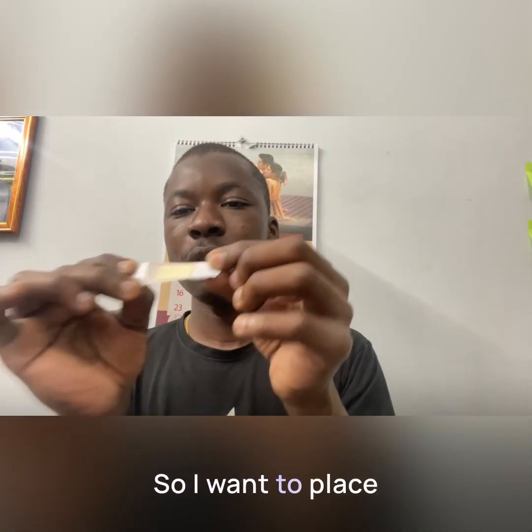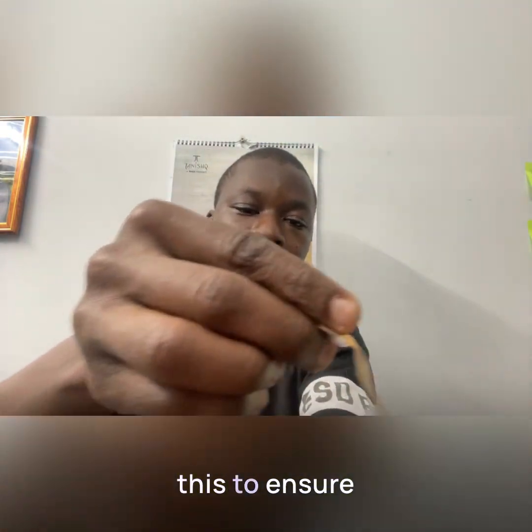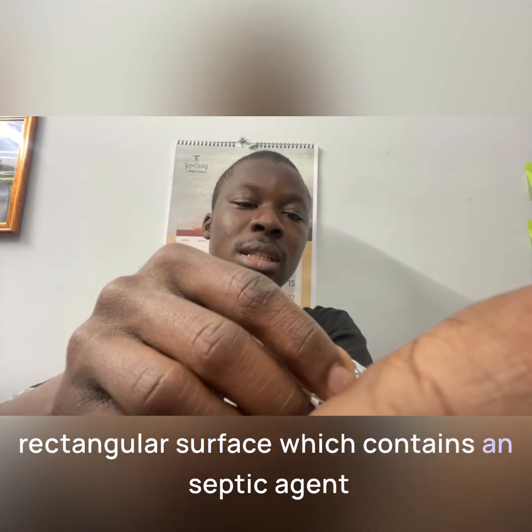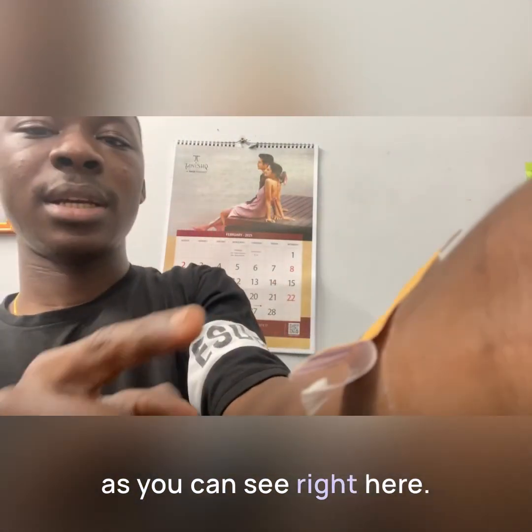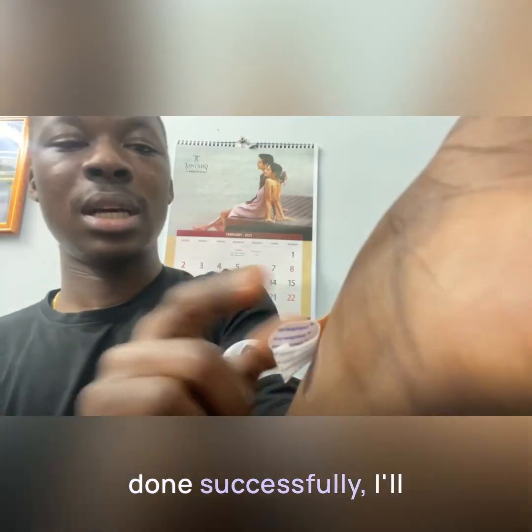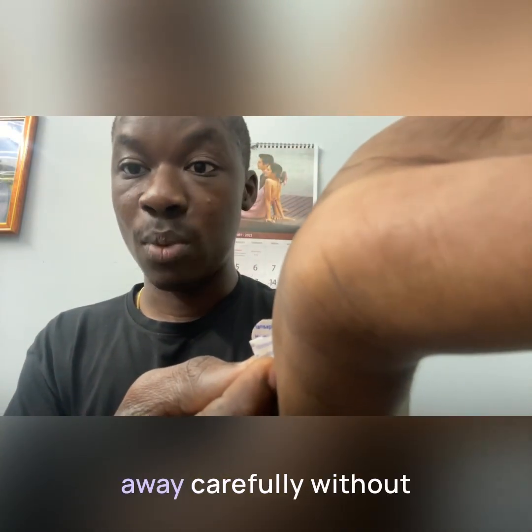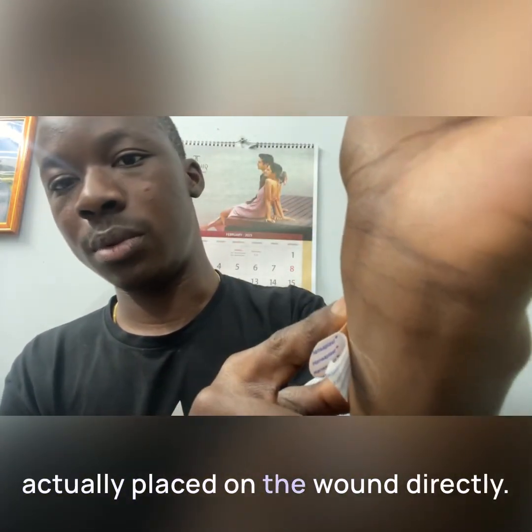So I want to place this now on my hand. I will apply it carefully like this. I will ensure the rectangle surface which contains the antiseptic agent is centered on the wound surface, as you can see right here. Once that is done successfully, I will carefully remove this covering part away, without removing the center one that's placed on the wound directly.